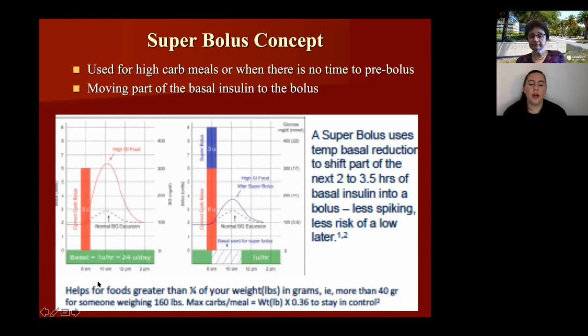Okay, so then what do you do if your blood sugars are steady overnight, so your basals are correct, but those percentages are still not equal? And they may not be equal. If you're very insulin sensitive, you could be having lower basal rates at night, and it could be a little higher basal rate during the day, or again, you're possibly making some of your own insulin, or you just could be an outlier and very insulin sensitive, or you're very physically active.